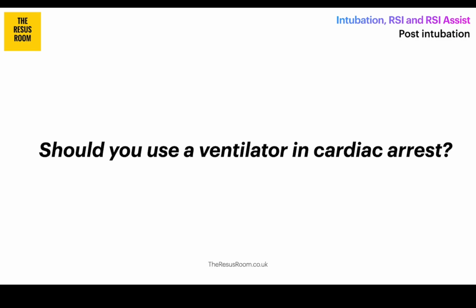And I might not automatically take them off the ventilator. But what I would do is be guided by some of that research that you've talked about, and I'd tweak my ventilator settings. So thinking about the mode, I would put them on SIMV. I would have the rate down to 10, and I would adjust the I to E ratio to 1 to 5, so you're delivering your inflations over 1 second. The tidal volume is going to be set somewhere around 6 mils per kilo. I take the PEEP off completely and set the FiO2 back up to 1 if you've been titrating it down.